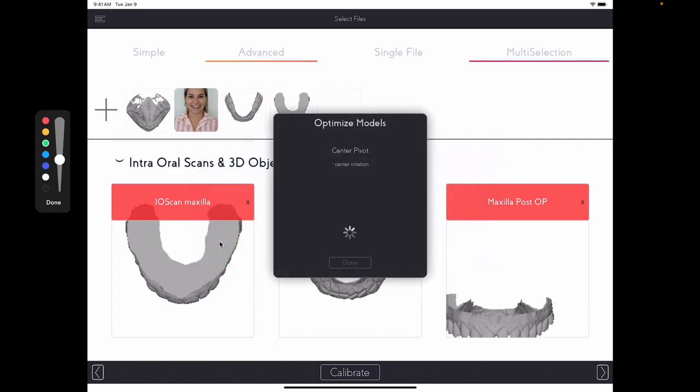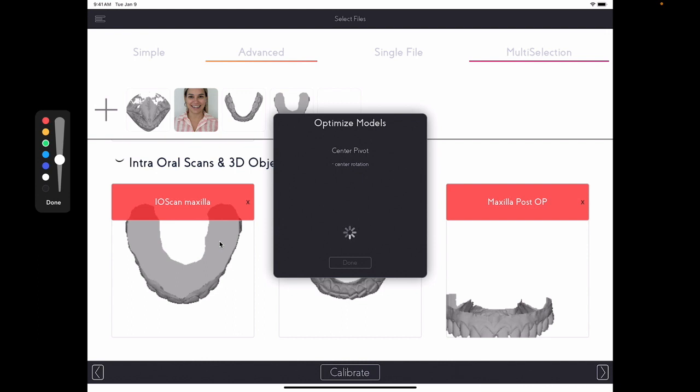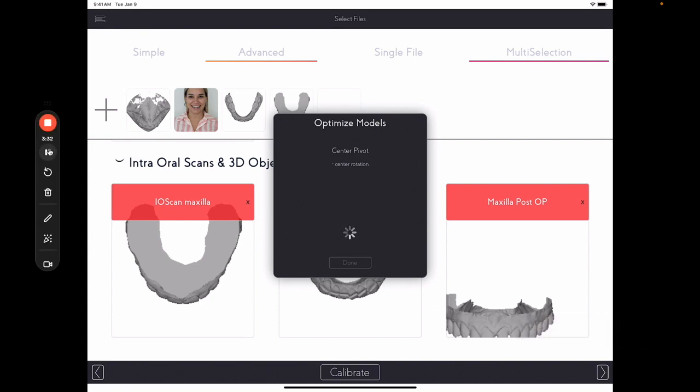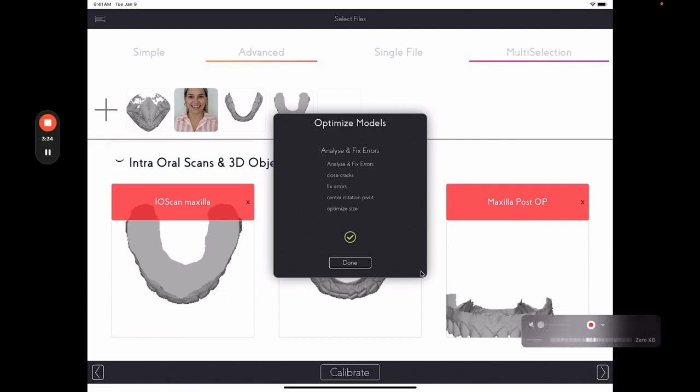And then the software, Smilefy, will now optimize the model, making sure that it is printable. This is a mandatory step if you want to export and print your models, which is the main goal of designing yourself. This process will take about 35 seconds to a minute, two minutes. It depends on the size of the file, it depends on your iPad or Macbook memory. And it is important that you leave the software working on its own so that it can complete its optimization. Once completed, click in Done.